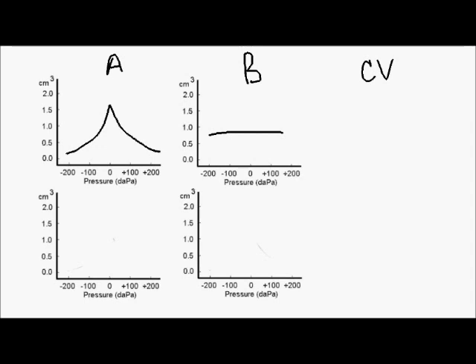The normal volume in an adult ear lateral to the tympanic membrane is about 1 cubic centimeter. If the canal volume measurement is 2 cubic centimeters or more, this suggests that there is a perforation, and the measurement includes both the middle ear space and ear canal volumes. If the measurement is close to 1, this suggests an intact drum with fluid in the middle ear space.